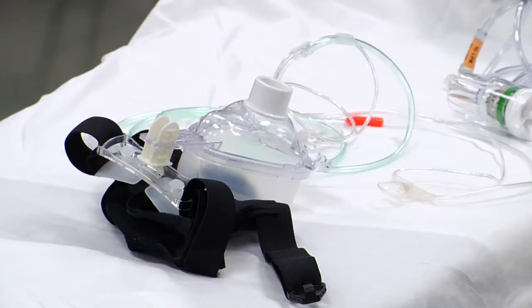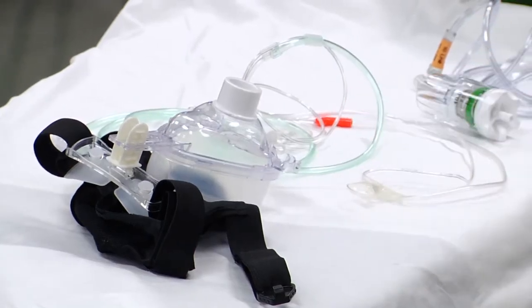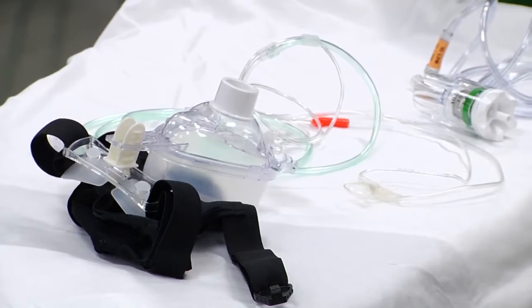Today I want to talk about application and use of CPAP. CPAP now has disposable devices from many different manufacturers, so it's much more accessible. We know that we could save a lot of lives with CPAP. The application of CPAP, though, requires some pre-planning, some thought, and probably some training so that you actually can do it effectively when it's necessary to apply.